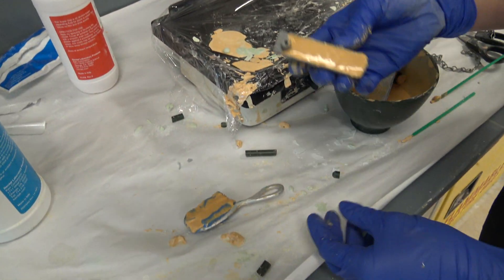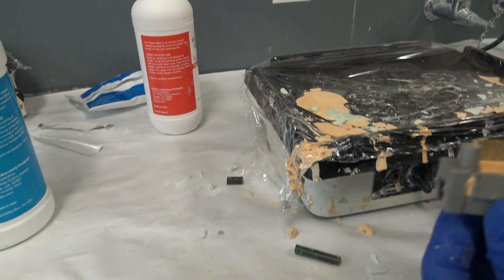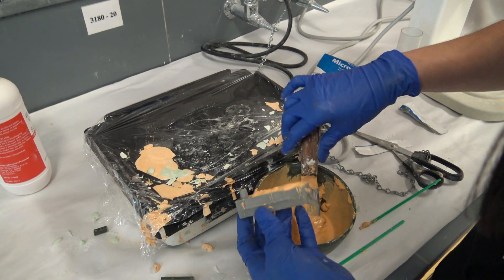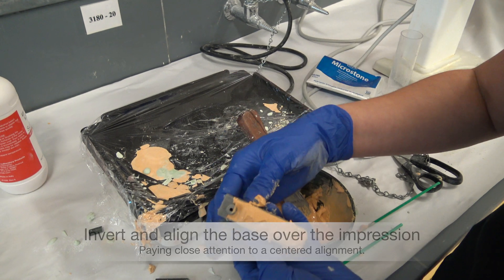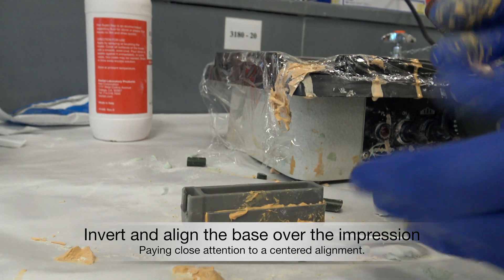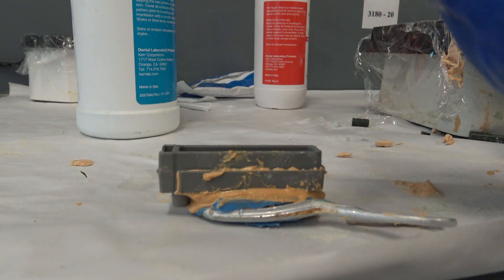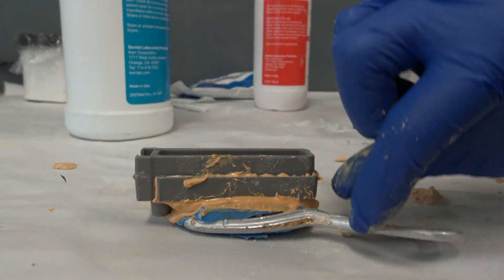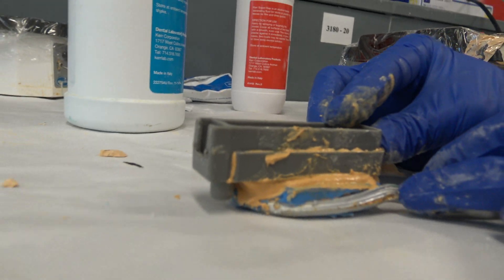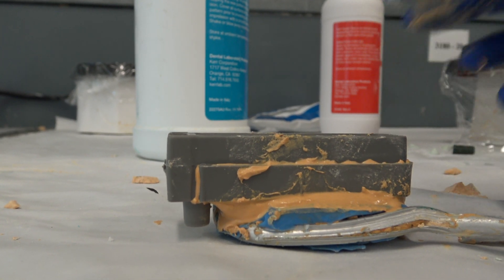As we're seating it, we want to try to get it as level as possible. We want the screw to be exposed on the back end, so we can move it just a tiny bit to make sure that we have good clearance. We're just going to let this dry now, nice and parallel, as parallel as possible.